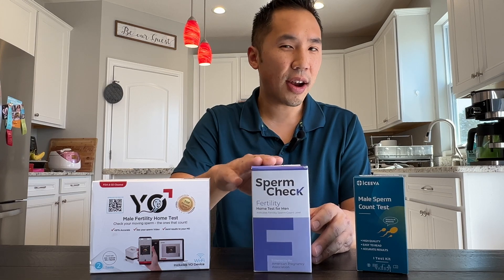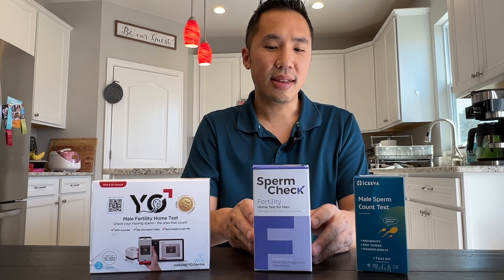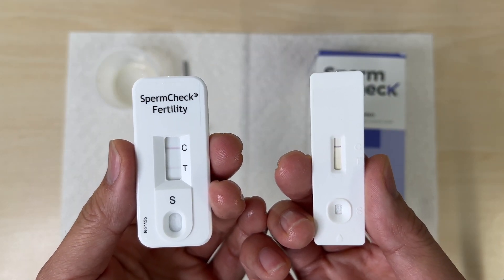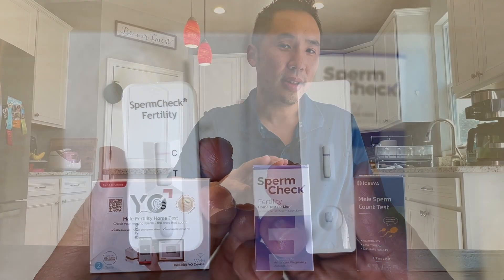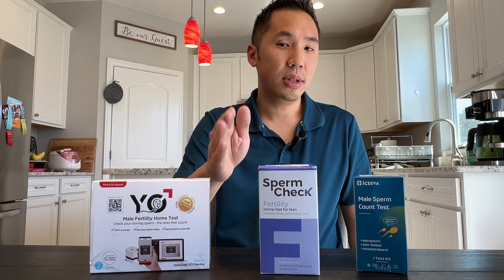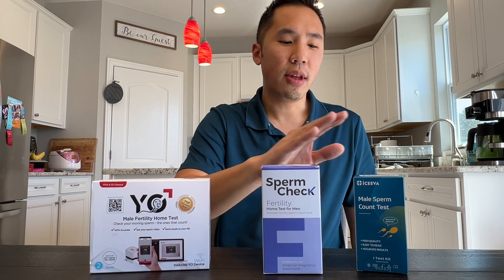For the SpermCheck test, this is a very similar test that also has a test strip. I found that this test strip was much more definitive. As you can see here, the line is much more bold, and this had a higher success metric as well. This measures for 25 million count per milliliter versus the 15, so I'm not sure why this was more bold versus the ISEVA.